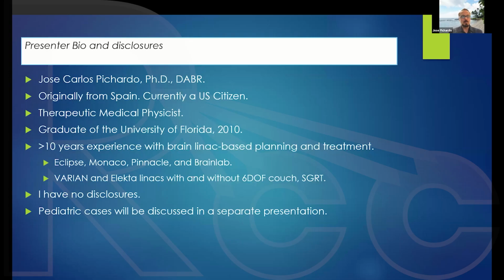This is a little information about me, but Justin has already mentioned it. I just wanted to indicate that even though some of the slides that I'm going to show today are mostly about Varian systems, I'm not paid by Varian, and I'm not promoting Varian. I have worked with both Varian and Elekta Linacs and different treatment planning systems like Monaco, Eclipse, BrainLab, and Pinnacle. Some of the things that I will show you may be more specific to Eclipse, but that doesn't mean that you cannot do them with the other systems.